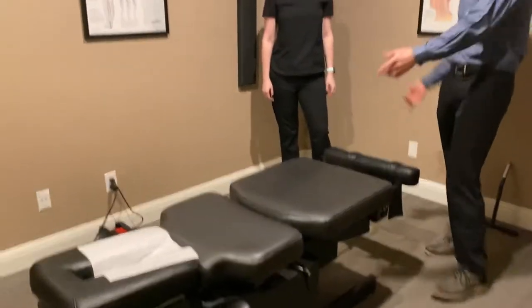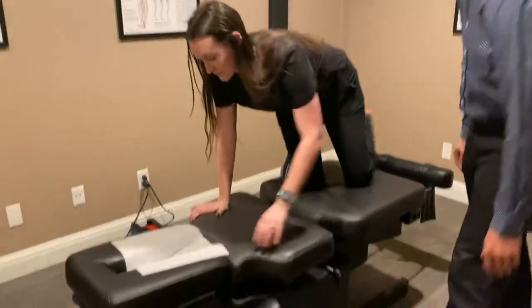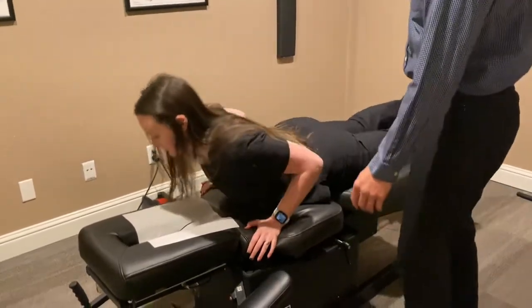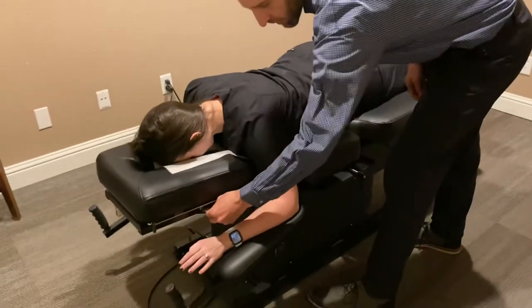I'm going to have my assistant Connor go ahead and lie on here. You're going to use the armrest to get down. We are able to unlock the face cradle.